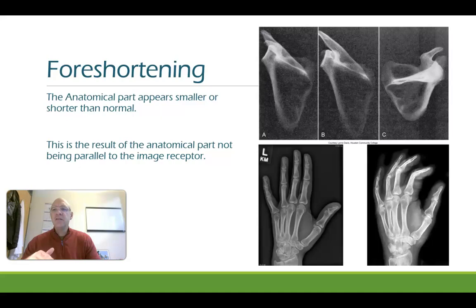It's now perpendicular to the board, but we've angled the scapula, upward or downward. I can't tell from this angle, but we've angled it. And from that, we get a funny looking scapula because it's now foreshortened.